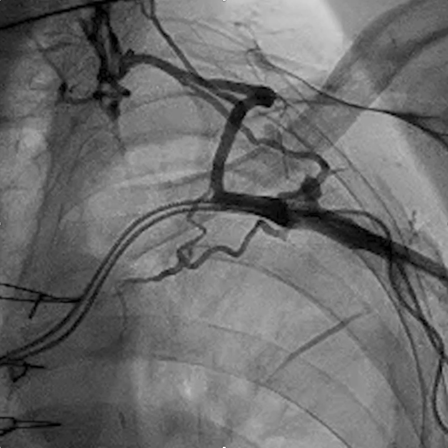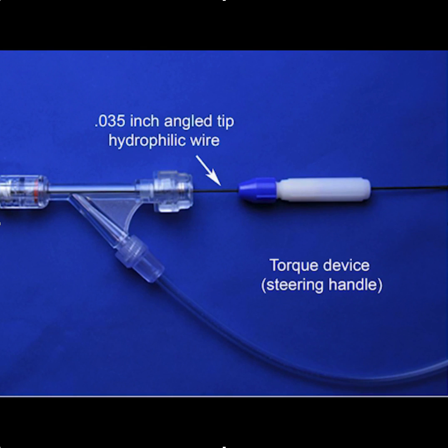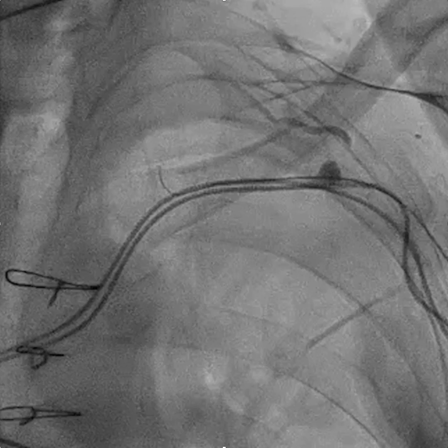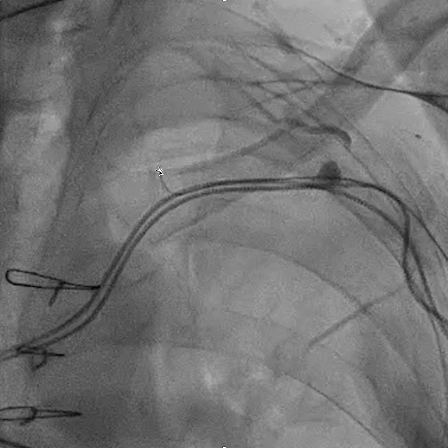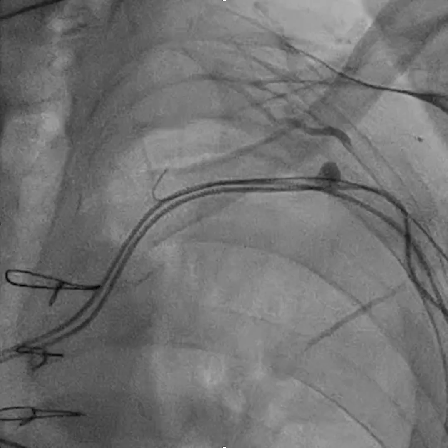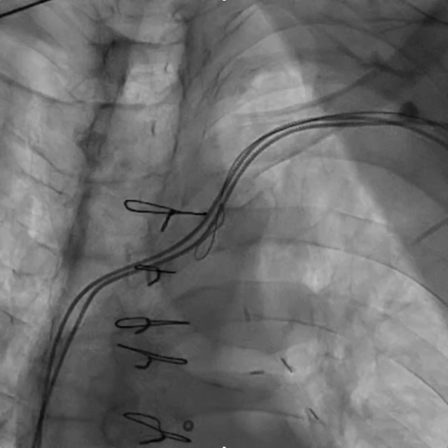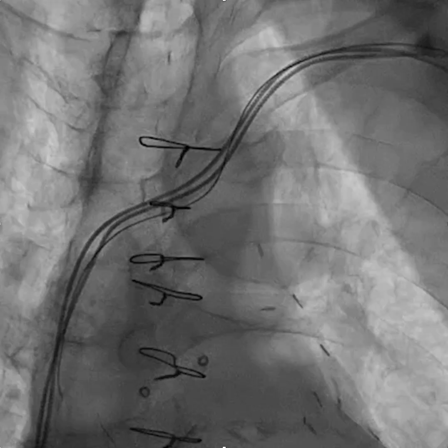Take heart — it's amazing how often a wire will go through that fairly easily. We take our 035 angled tip hydrophilic wire, a typical glide wire, in a torque device, and put it through the hemostatic valve of the injection system. Very easily in this case, the glide wire follows through the occlusion and down into the central circulation.